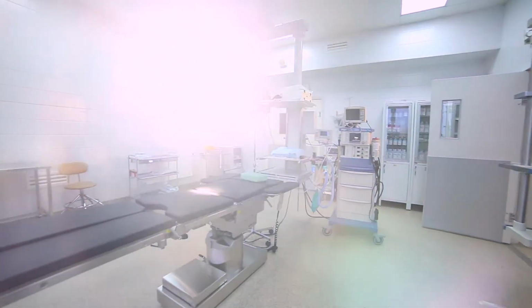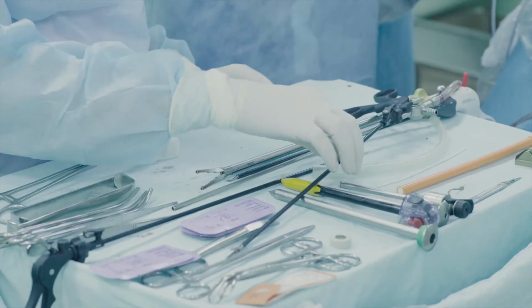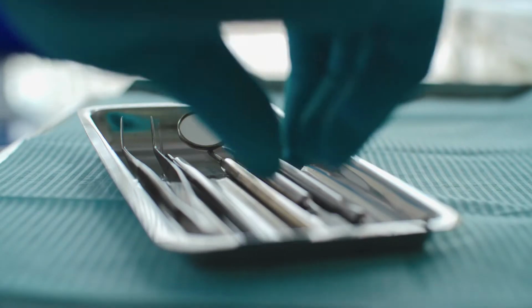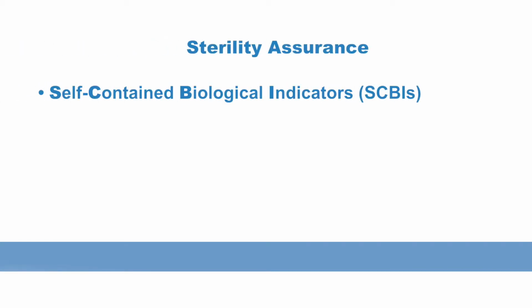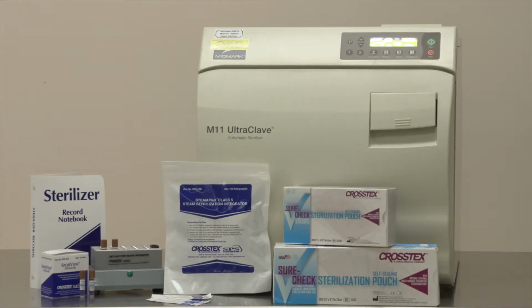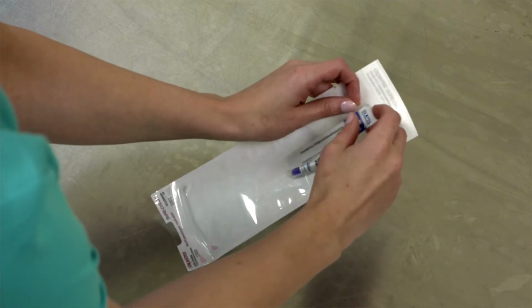Whether you work in a hospital or an industrial setting such as a pharmaceutical company, medical device manufacturing, or research facility, ensuring that instruments, medical devices, and equipment are sterile is critical. Medical professionals frequently work with self-contained biological indicators, or SCBIs, in order to monitor critical sterilization processes. Indicators that are self-contained reduce the risk of cross-contamination and subsequent false positives.